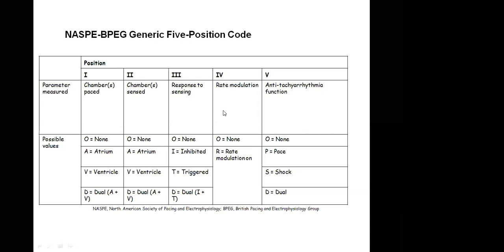So the last code for a pacemaker is the rate modulation. I think we tried to explain this: nobody's heart rate is stagnant. The heart rate at sleep is different from the heart rate while jogging. So you should activate the rate response code. The reason is that if a patient is pacemaker dependent and you don't activate the rate response, it simply means the patient can be on a permanent heart rate of 60 beats per minute. That will suffice when he's sitting down, lying down or sleeping.